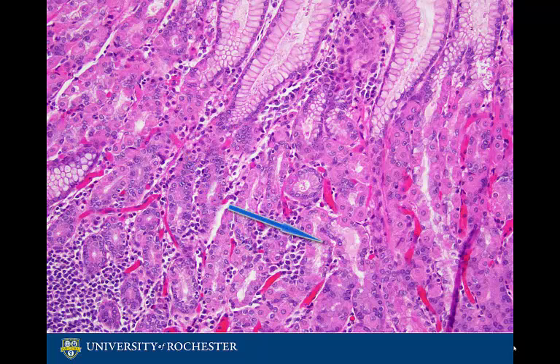Chief cells are located in the base of fundic glands. They are quite ordinary in appearance and secrete pepsinogen and a weak lipase.